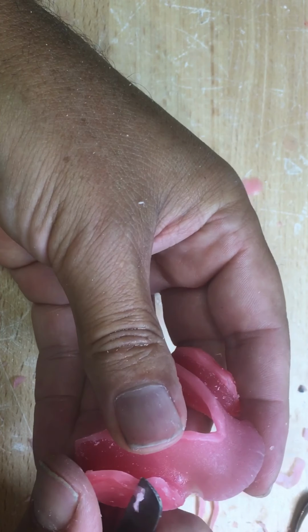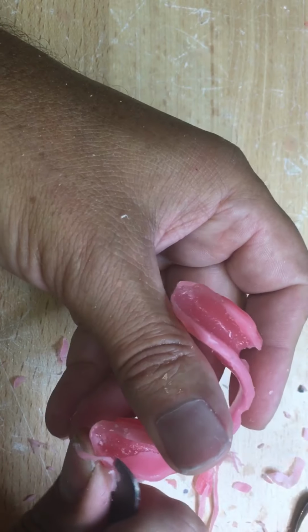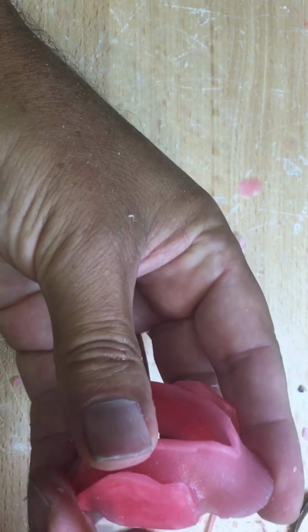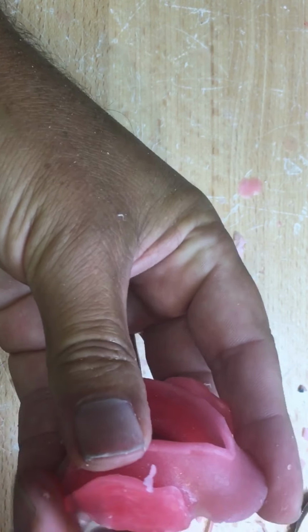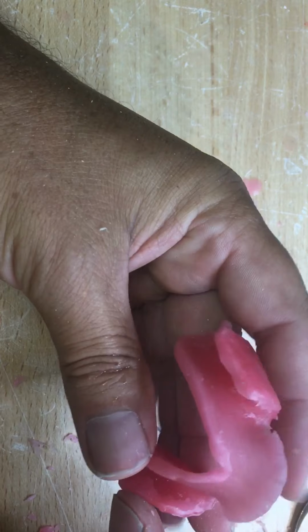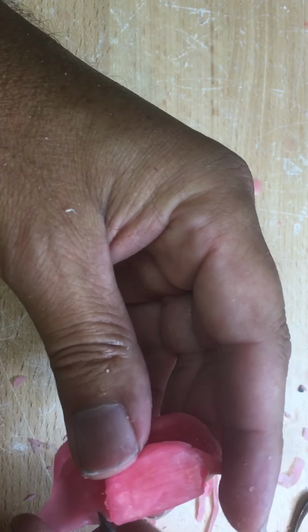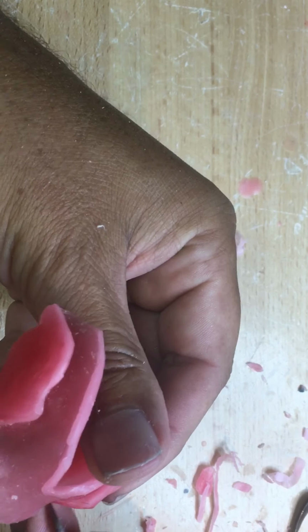I don't have confidence that the extensions are correct. Well, I have confidence that my educated guess at the attached and detached mucosa is correct, but still, nevertheless, I'm going to err on the side of safety and say, well, maybe I didn't guess correctly. We'll make that nice and smooth. No sharp edges, no flakes, no breaks.